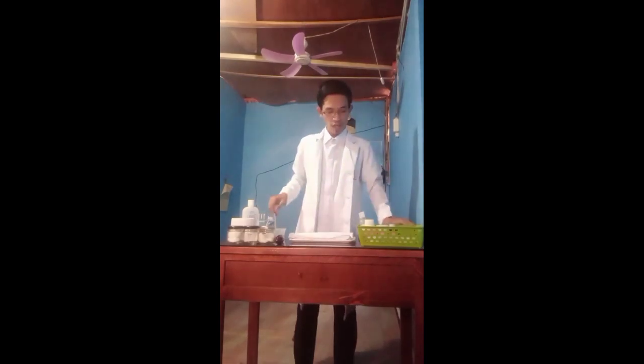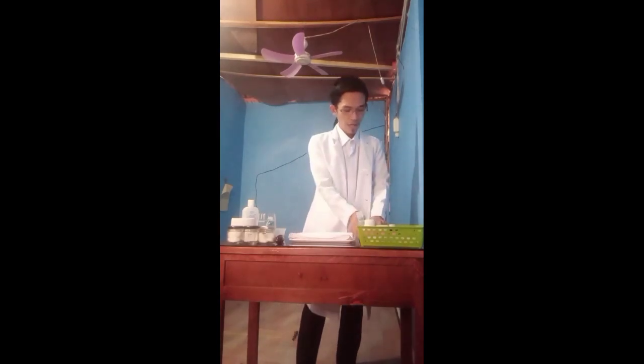And also I have here the doctor's order sheet, the medication sheet, the medicine tickets, and the waste receptacles.